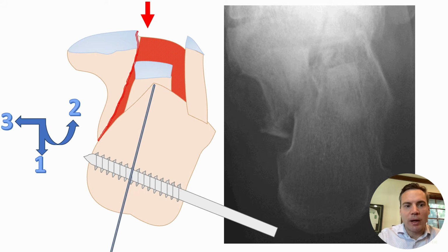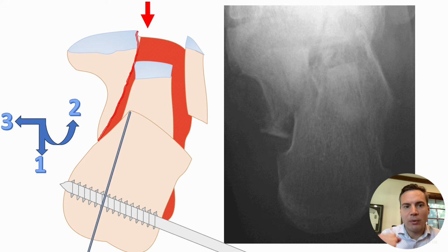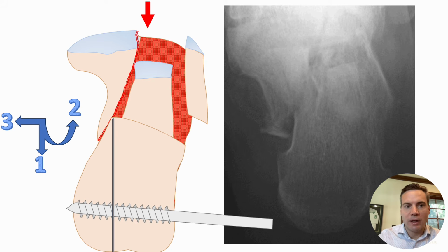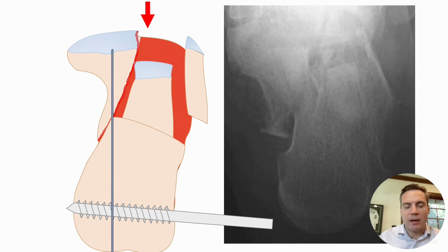Well, when we go to correct the deformity, we pull out the tuberosity, we regain height, we correct the deformity, we narrow it, and then we pull it back in, pull it out of varus. Now our K-wire is positioned in such a way that we can advance that and it provisionally holds that tuberosity piece in place.